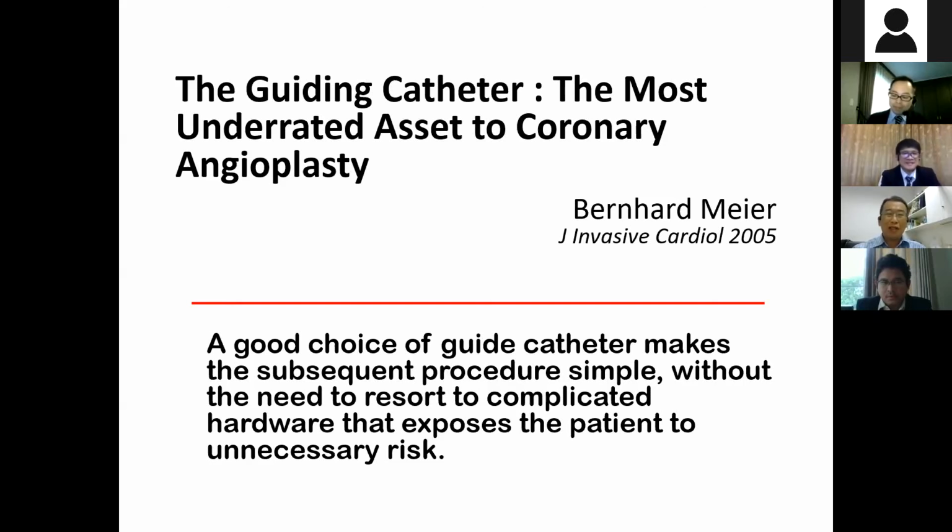That means most interventionists do not pay attention to or give importance to this basic device. A good choice of guiding catheter makes the subsequent procedure simpler, without the need to resort to complicated hardware that exposes the patient to unnecessary risk and cost.